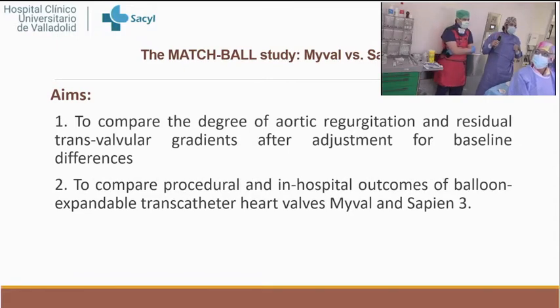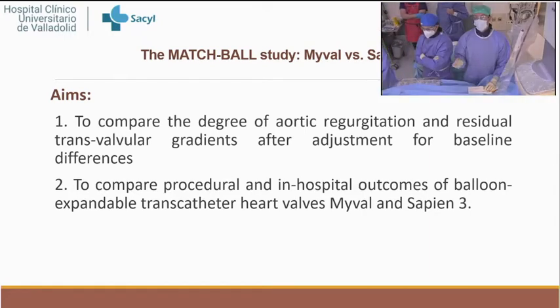Actually, Alain, I don't think it's so important with balloon expandable valves for the coronary access, because normally it's quite easier than with self-expandable. But there are some publications suggesting that when you are not well aligned with the native commissures, you have higher gradients and higher progression of gradients in the follow-up. And this is the reason why we do it with balloon expandable. Here it is just rotating the device when we crimp it. With other devices, what we need to rotate is the delivery system before entering the patient, but not with balloon expandable ones. Okay, fine. Thank you very much.